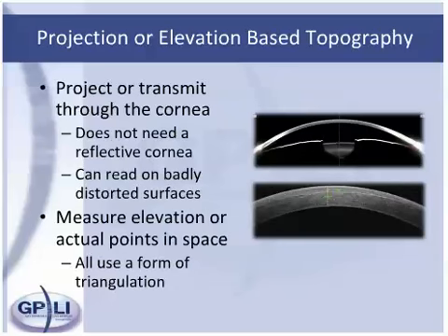Elevation-based systems project or transmit directly through the cornea. They do not need a reflective surface in order to capture an image. Therefore, projection-based systems are excellent on highly distorted surfaces. These systems measure actual elevation points in space, determining what is high and what is low.